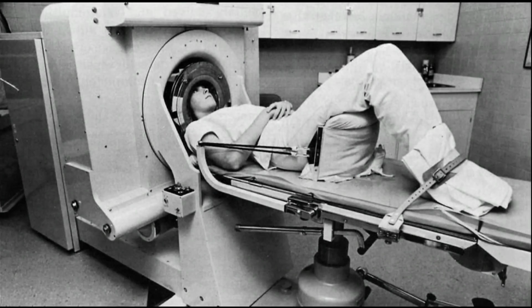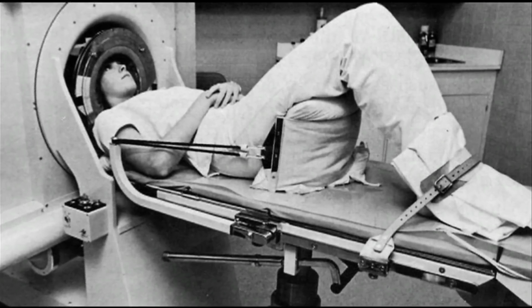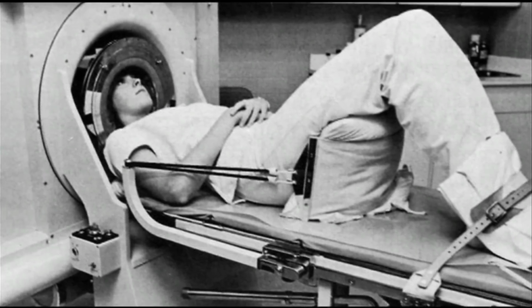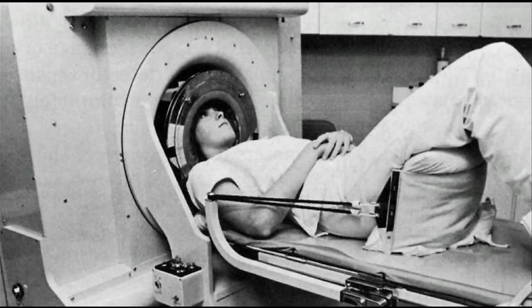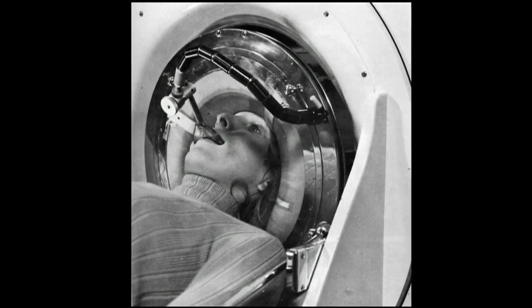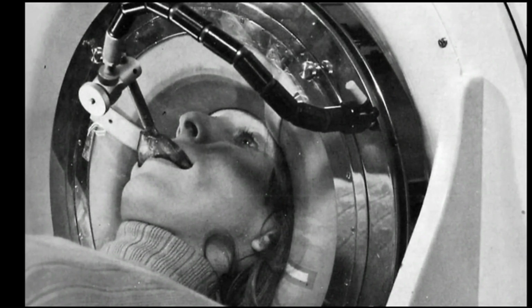This is a picture of that first clinical scanner. The whole system was relatively small since nothing bigger than a human head had to fit in the center. Notice the sling around the patient's bottom that held the head firmly in the center of the scanner gantry. If you still couldn't control yourself and hold still for the entire exam, the technologist could place this bite block on the frame of the machine. The combination of the bottom sling and bite block absolutely ensured patient cooperation even in the most difficult situations.